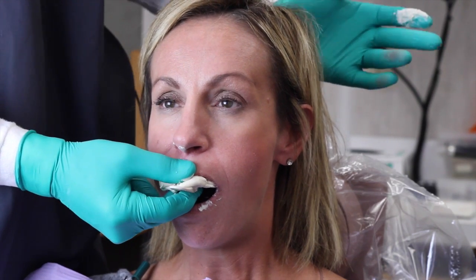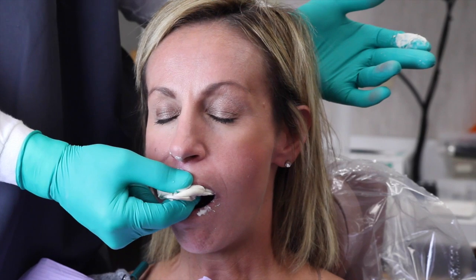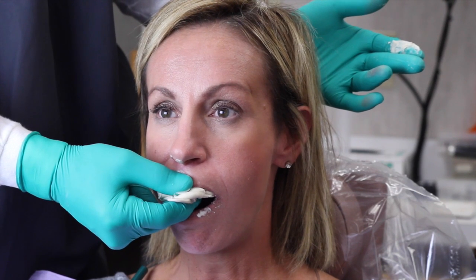Now, if a patient is a moderate gagger, here we'll instruct the patient to breathe through their nose. And actually tell them, actually focus. Think about breathing through your nose, Debbie. Okay, a little louder so I can actually hear you. And that seems to be very helpful.